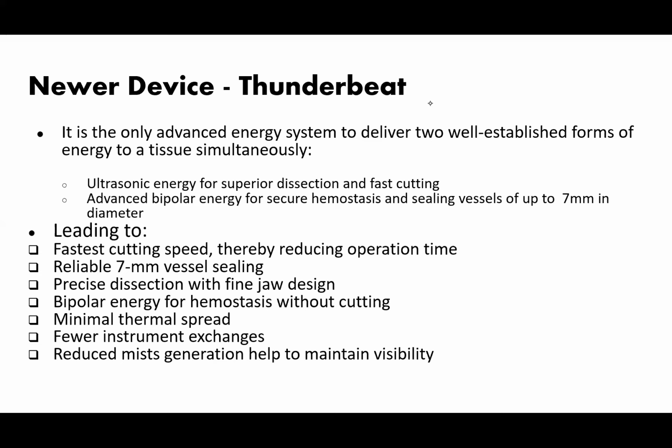The ultrasonic energy for superior dissection and fast cutting. The advanced bipolar energy for secure hemostasis and sealing vessels of up to 7 millimeters in diameter. So you can see this has combined an advanced bipolar and the ultrasonic energy, leading to what?